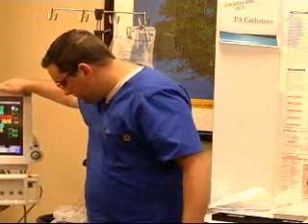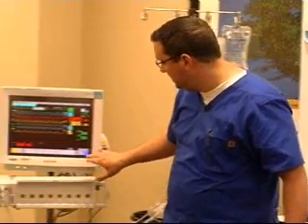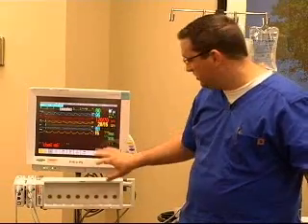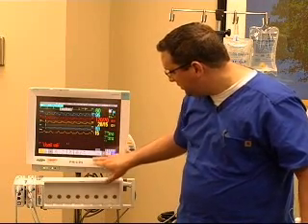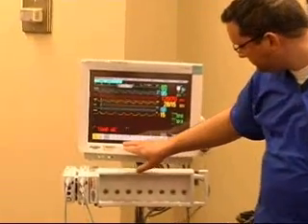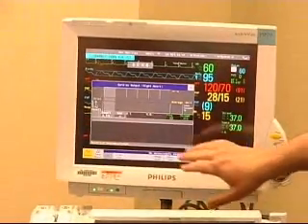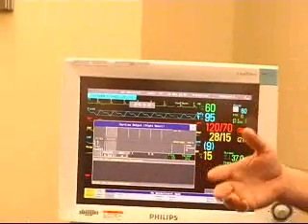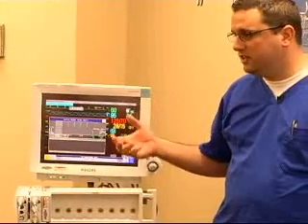Now on the monitor system, this is in demo mode, which exists in demo land, which is not real, by the way. But you can see all these wonderful, nice, pretty tracings, okay, which is great. And we hope that's how our monitor would look. But if their patients look like this, they really shouldn't be with us, probably. So what you're going to look for is on the bottom line of the screen here, we're going to find our cardiac output, which is listed there. There's a couple things you want to note here, okay? When you're putting a new line in, if you're the first one who's doing this output, and actually when you do each one of your outputs, you really should confirm this, but especially at the very first one.